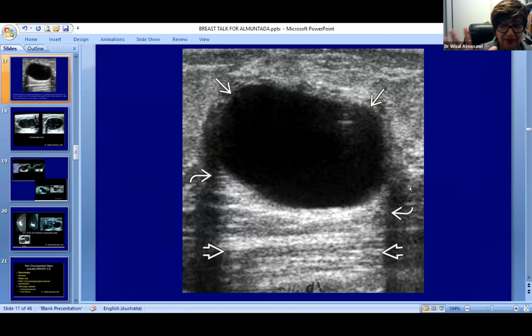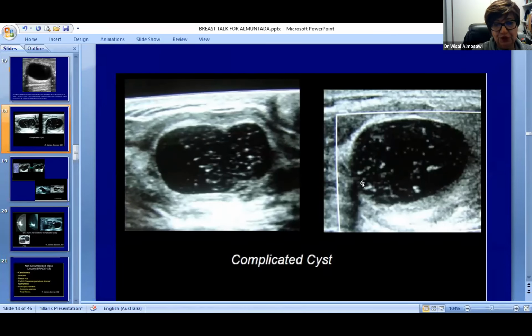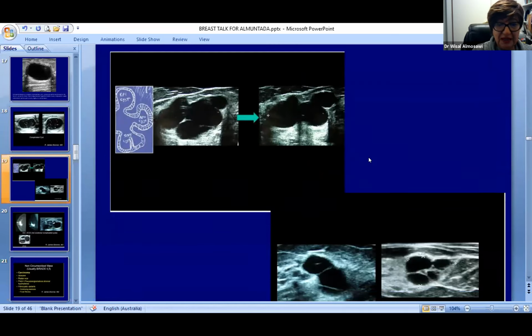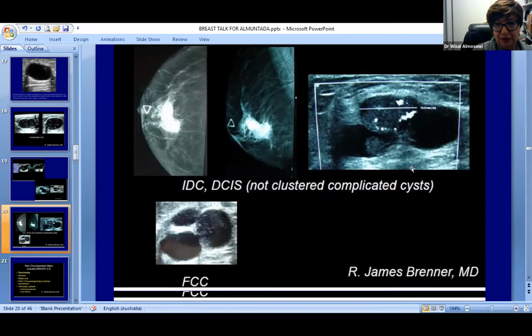Sometimes if it's big enough, bothering the patient, we just put a needle and aspirate it. Sometimes you end up with a complicated cyst. It could be hemorrhage. It could end up with infection, abscess formation. This one we usually try to aspirate. Multiple fibrocystic changes, very common finding in the breast. Sometimes you see cysts, but then a tiny little nodule. Once you see a solid nodule with vascularity, you worry about it. It could be intraductal papilloma. So we have to biopsy this, and we have to biopsy the solid nodule.